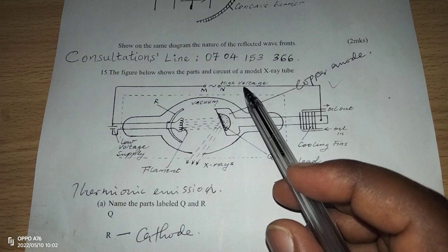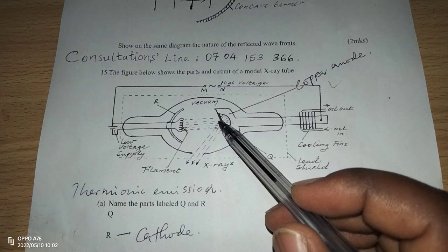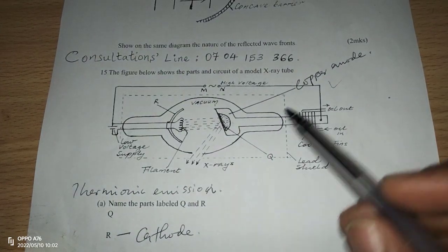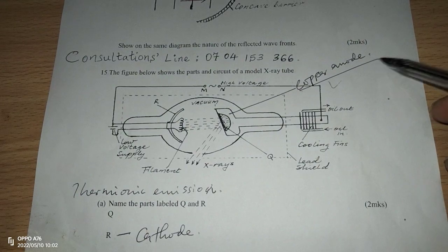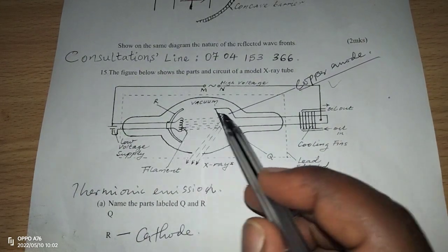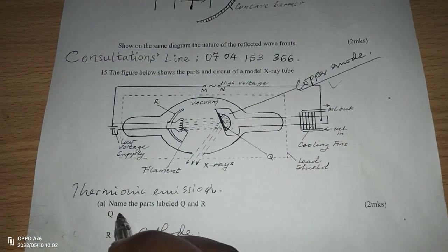Because it is in the positive potential, it is going to attract electrons. The role of the copper anode is to accelerate electrons from the cathode to the anode. What we have here at Q is a target, and the target is made of a material called tungsten.